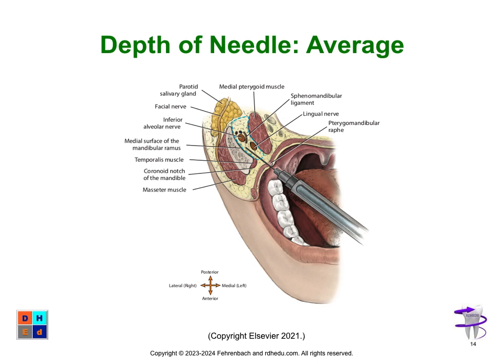There's the temporalis. Again, we want to be able to get around that temporalis muscle. There's that medial surface or inner, and there's that sweet spot of the IA. Notice again, there's the lingual. We're going to get it. It will, again, saturate the lingual nerve. We're going through, again, the pterygomandibular raphe.